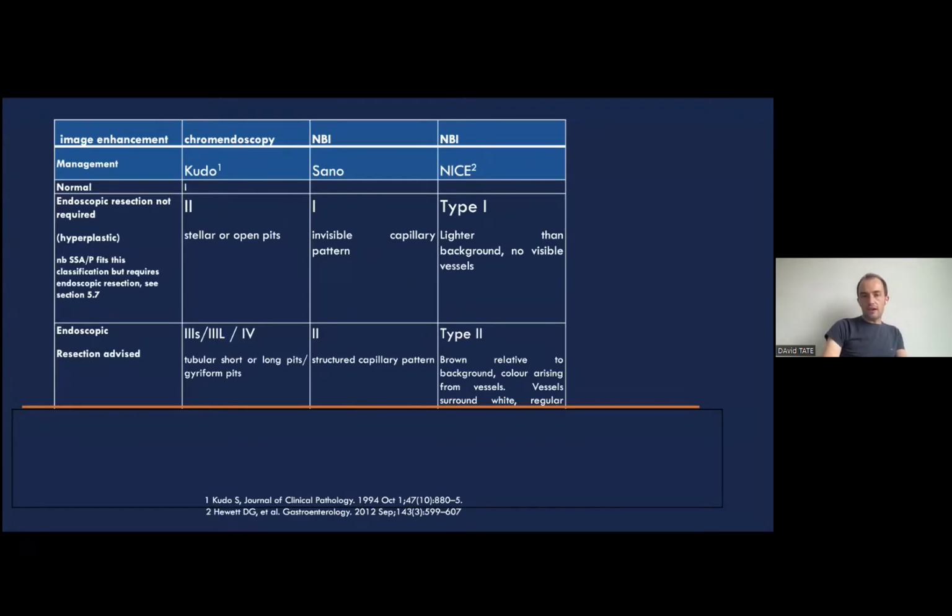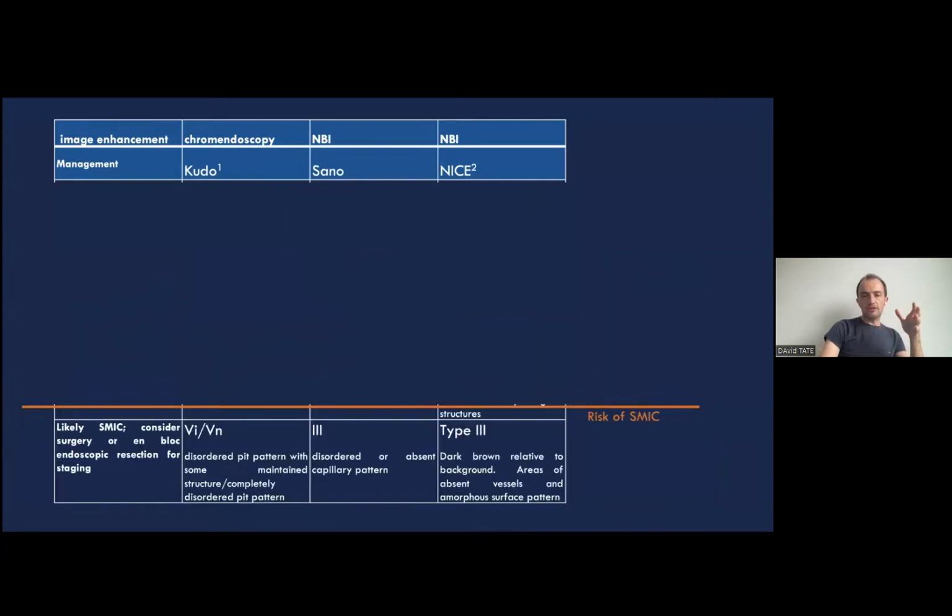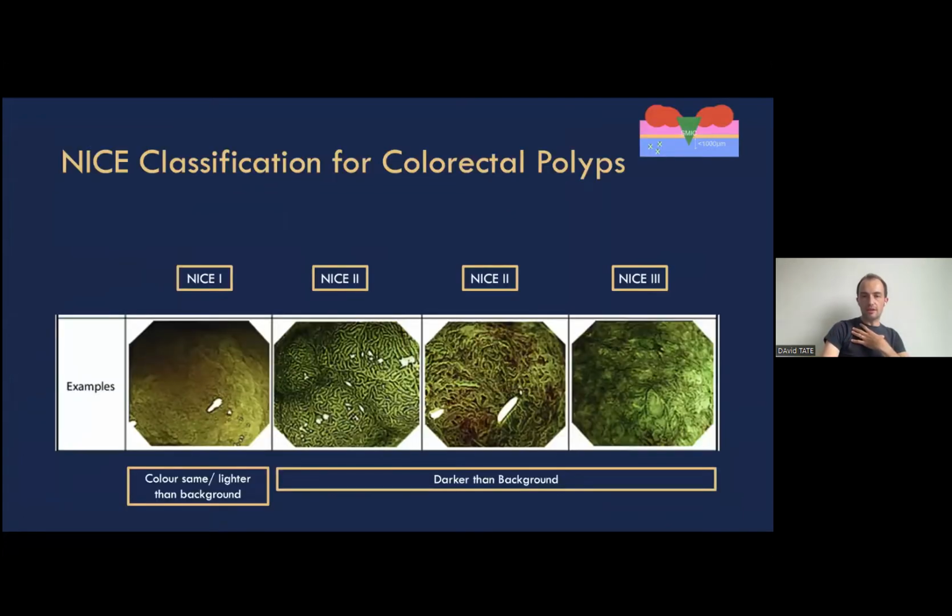Here we have a chart about lots of different ways which people have worked out over the years of figuring out whether a polyp contains cancer or not. But I would suggest to you that none of that is very useful in everyday practice, because it's quite difficult, it's quite cumbersome, and it's quite annoying to use in clinical practice. So I would suggest that this is really all that you need to know. When you look for and find a demarcated area within a polyp, which you think may be the area which might contain cancer, then this is what you need to know.